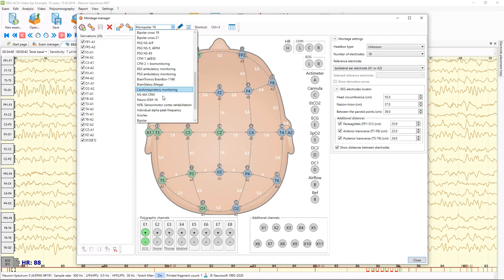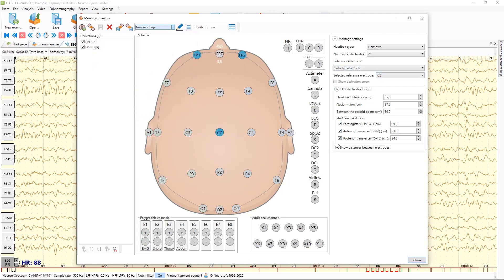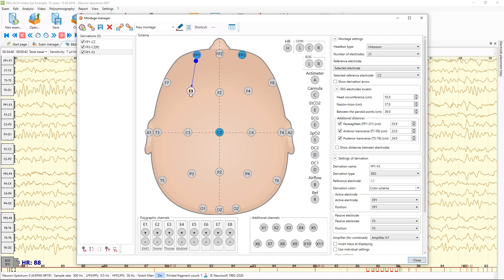Let's come back to our new montage. Now I'll show you how to add bipolar derivations. You can just press the left mouse button on the first channel and move it to another channel — like this.